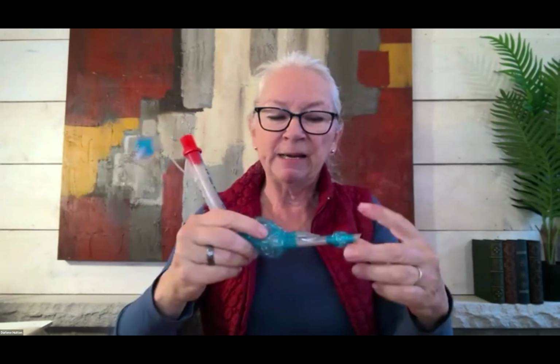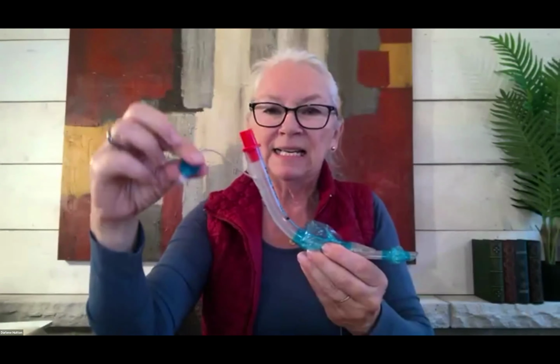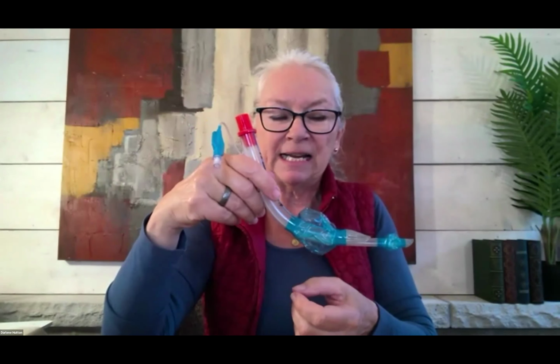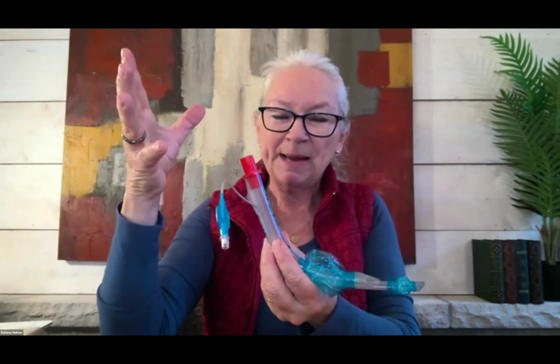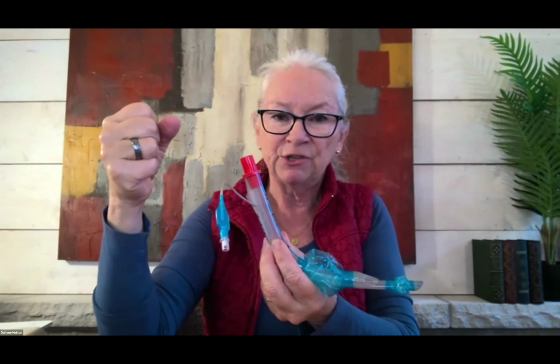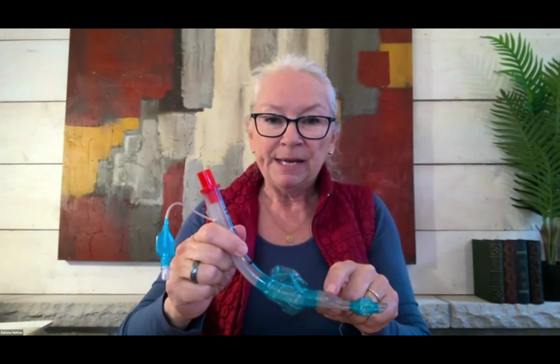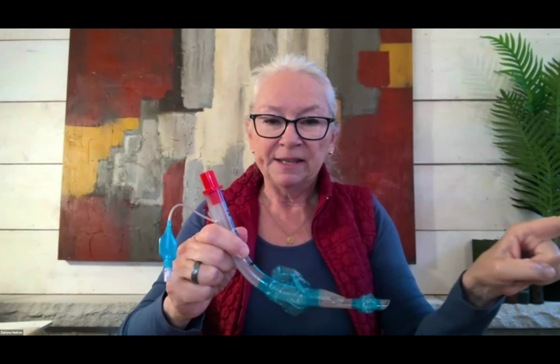Once you meet that resistance, you're going to inflate your cuff, and it will inflate both of these at the same time. When this feels like a soft grape, then you don't need to insert or inflate any further. You attach your filter, your Ambu bag, and then you assess to ensure that you are getting air entering. Air will come up here into the trachea, into the lungs.